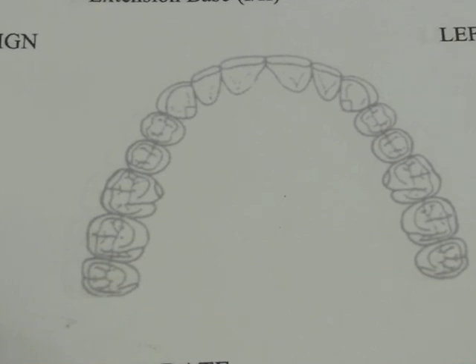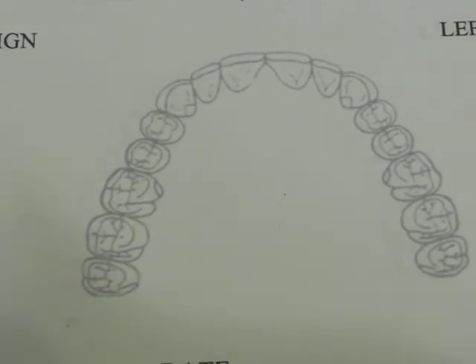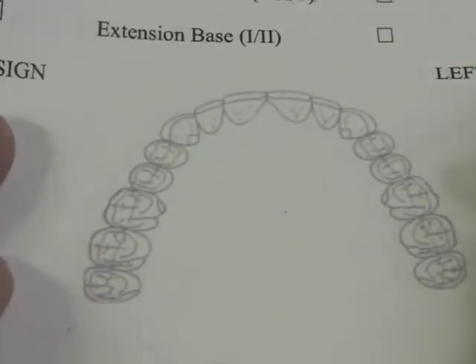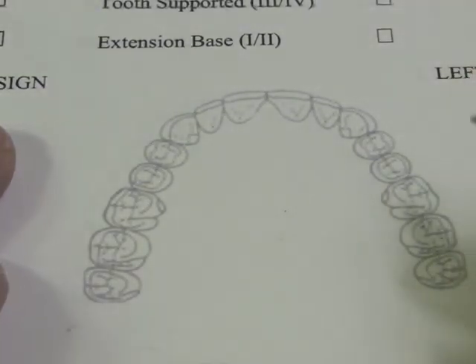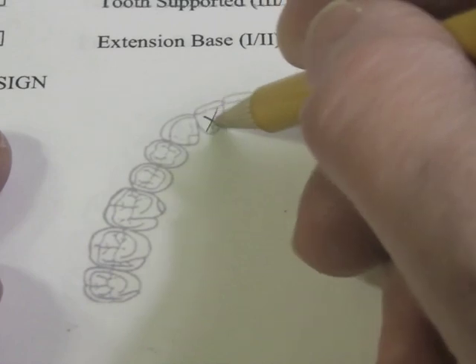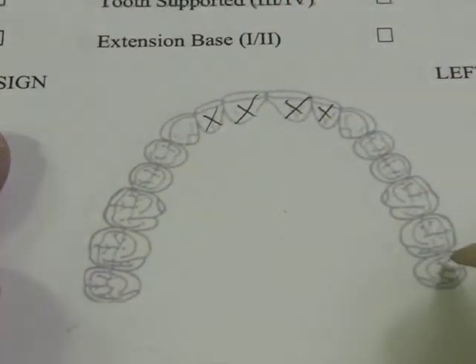Let's transfer our design to a piece of paper for our tentative design sheet. You'll be doing this for any clinic case that you're treatment planning. First thing we're going to do is cross off the teeth that are missing on our cast.